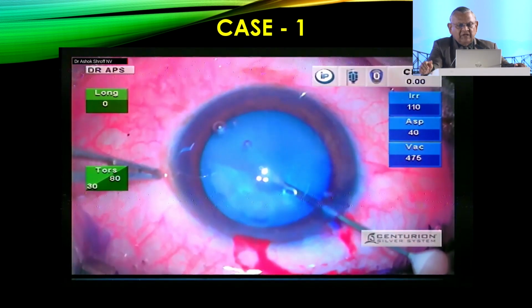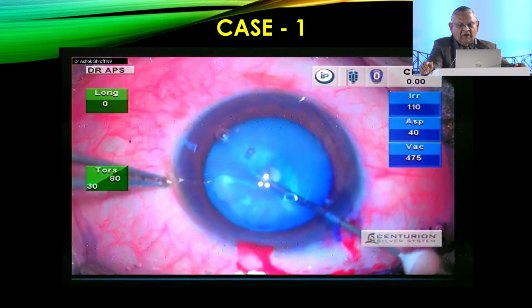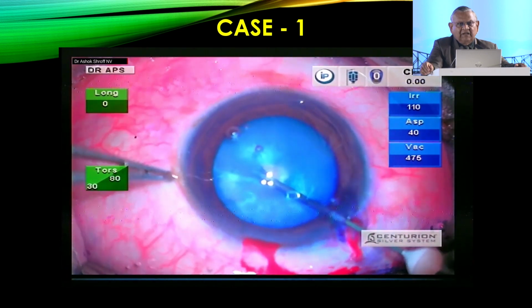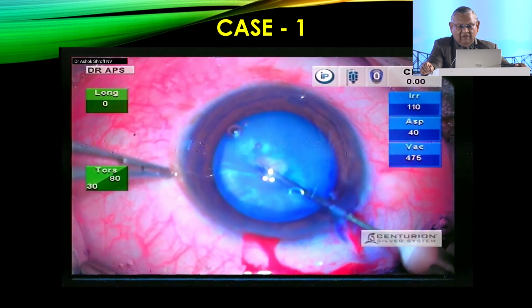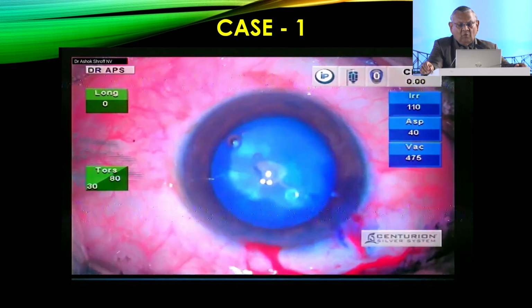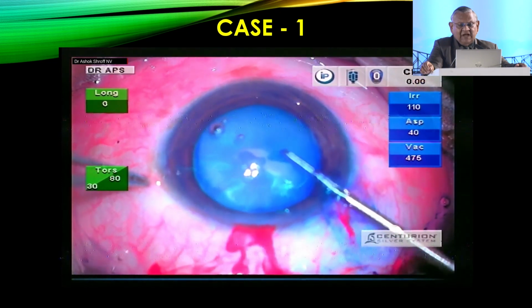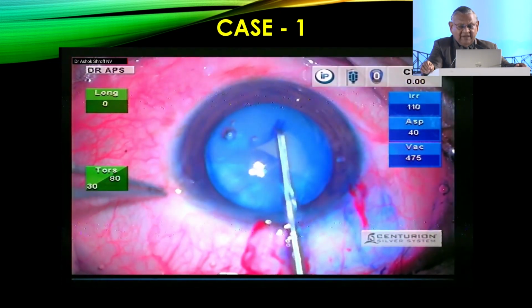Again, as mentioned earlier, it is very important to debulk the nucleus. However, you have to be very careful. The rhexis may not be as you want it. But once it is done, the lens is debulked and you can continue with the rhexis.